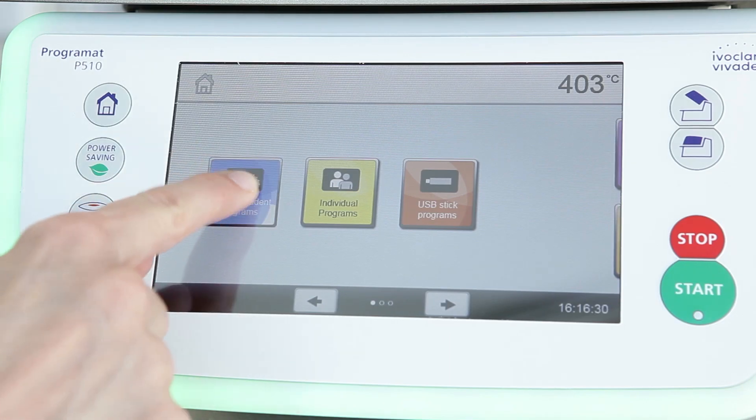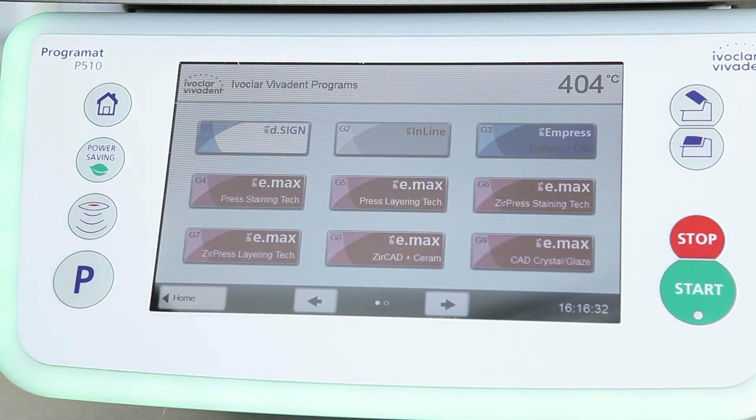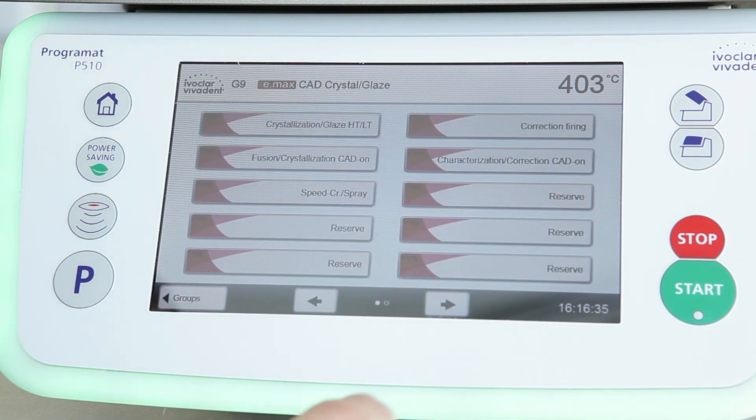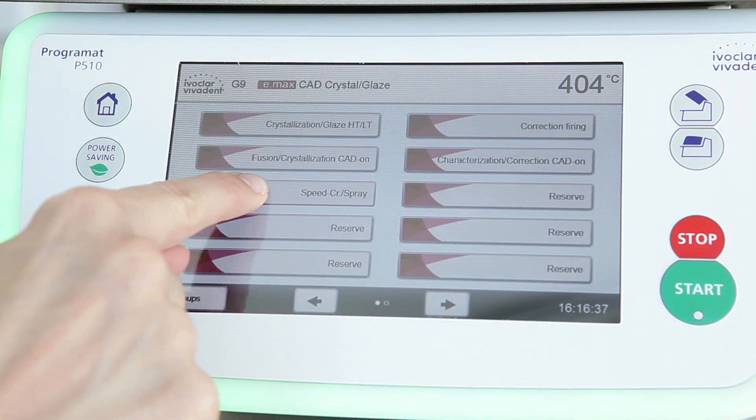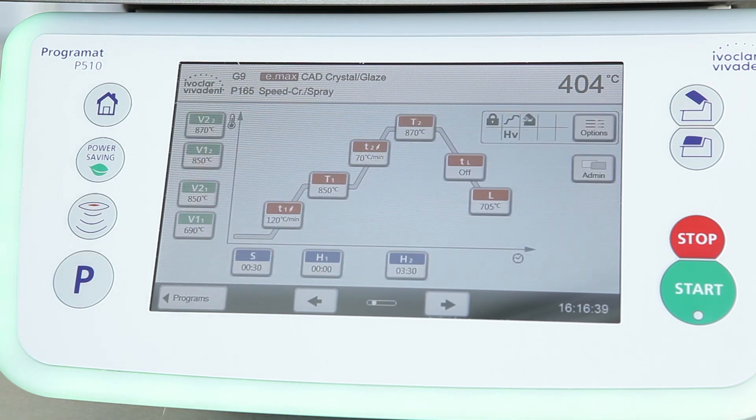Position the crown on the IPS Emax CAD speed crystallization tray. Place the tray in the firing chamber and fire the crown using the pre-installed firing program.